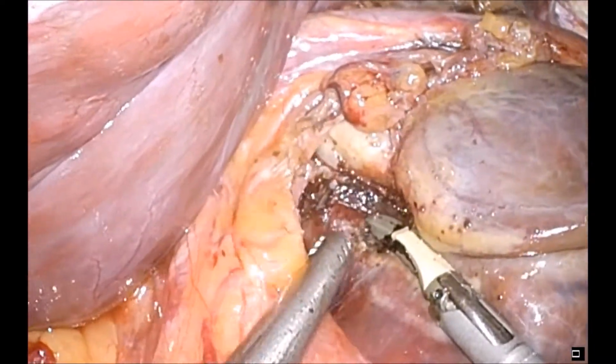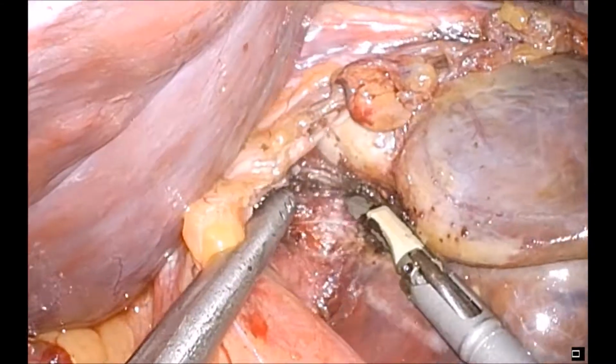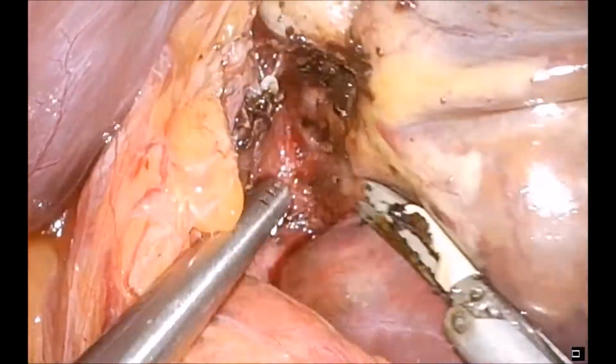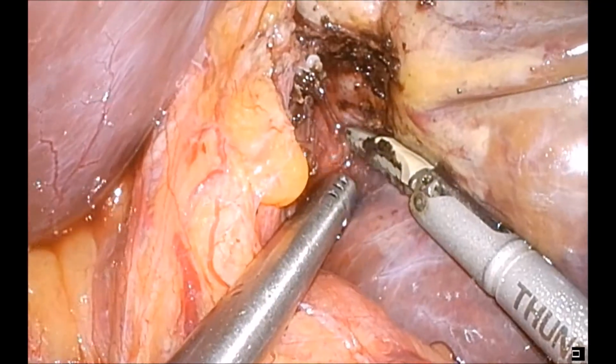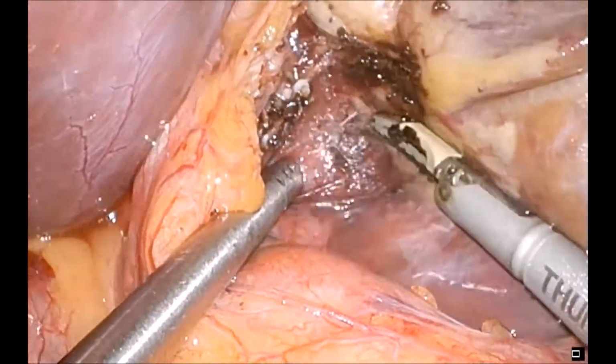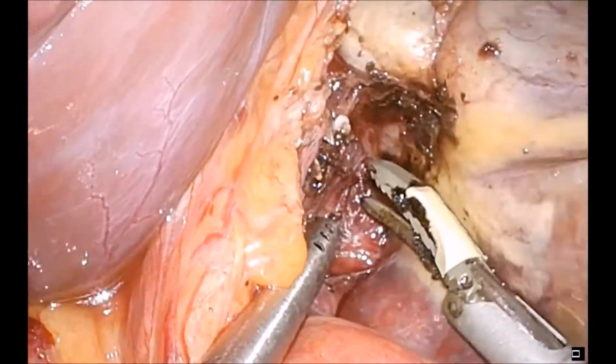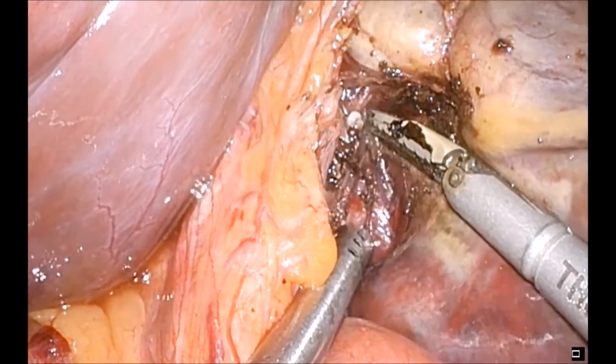These are taken with bipolar diathermy and cut using the harmonic part of the Thunderbeat. A lot of blunt dissection was used in this operation to develop tissue planes rather than what is often the case in liver surgery, which is parenchymal destruction.